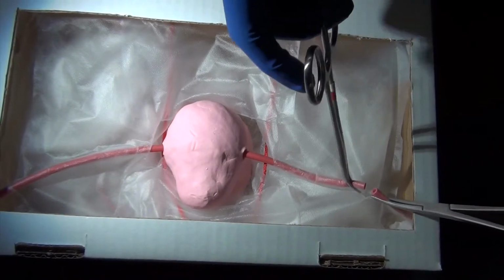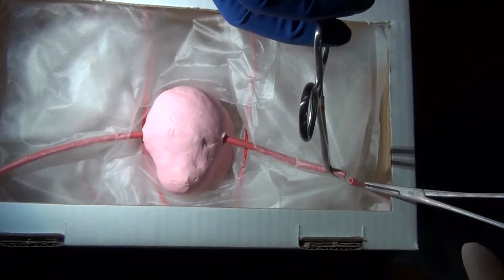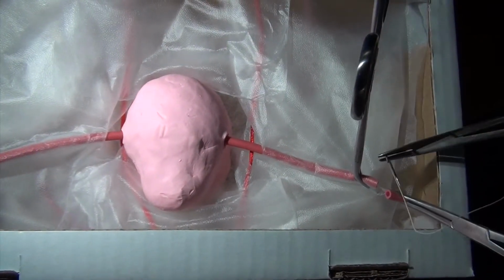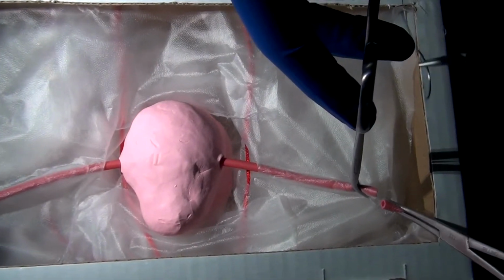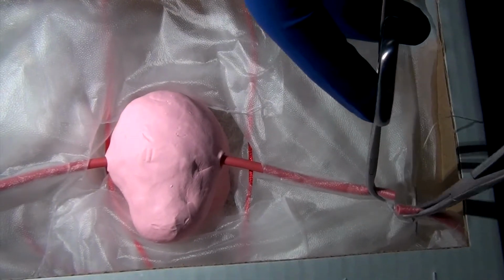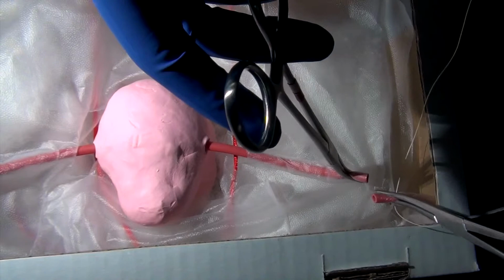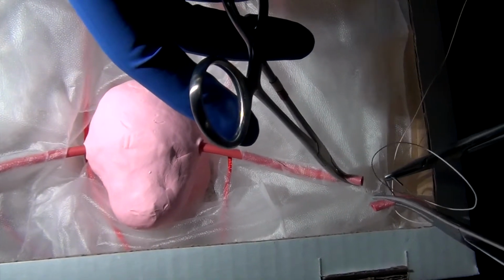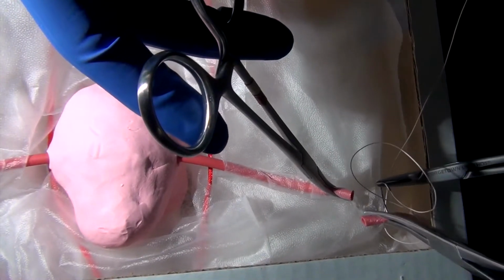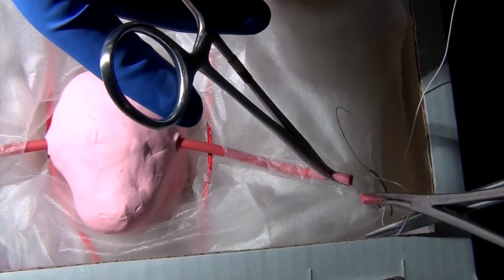Very important when we suture ligate the round ligament, it's important that we do a transfixing suture ligature because the artery of Sampson runs through the round ligament. So I'm going to transfix my round ligament. I'm going to come underneath my round, and then I'm going to come through my round. And for the sake of the model, I'm going to come behind the clamp, although we would be in front of the clamp because I'm pretty distal on the round ligament.